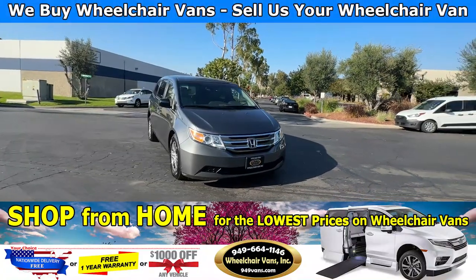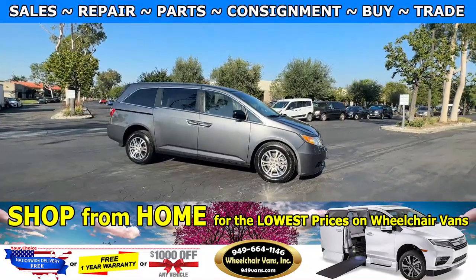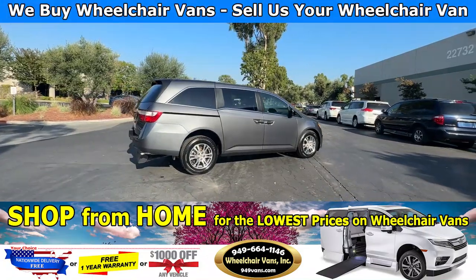Hello and welcome to Wheelchair Vans Inc. Today I will be going over a 2012 Honda Odyssey equipped with the BraunAbility manual rear entry ramp.